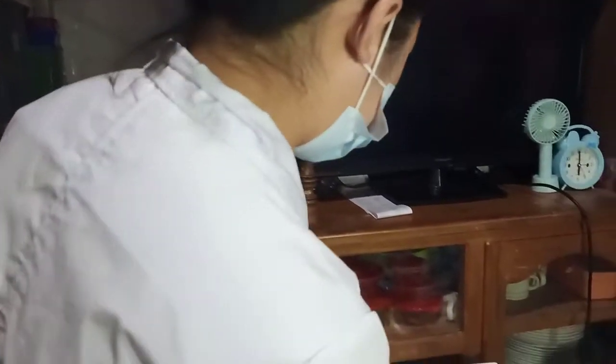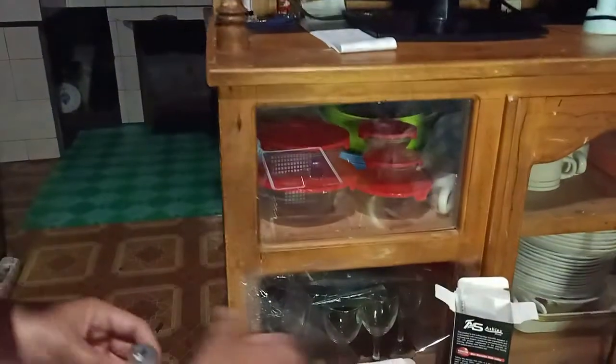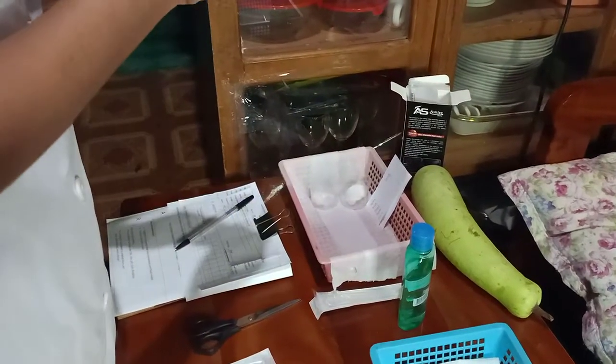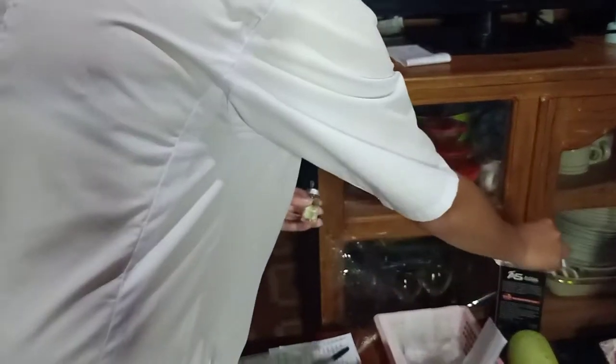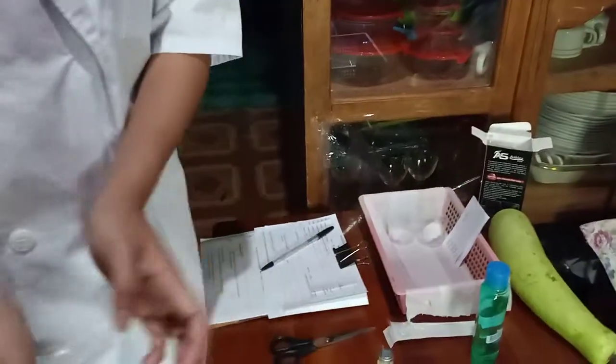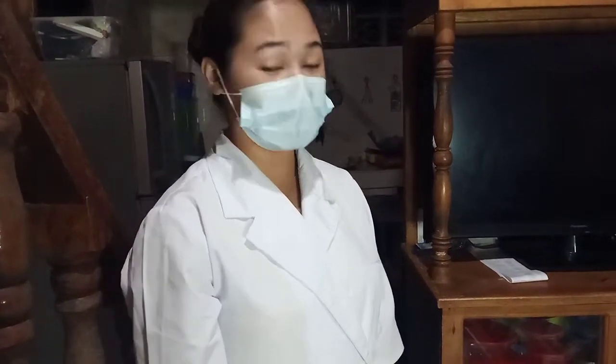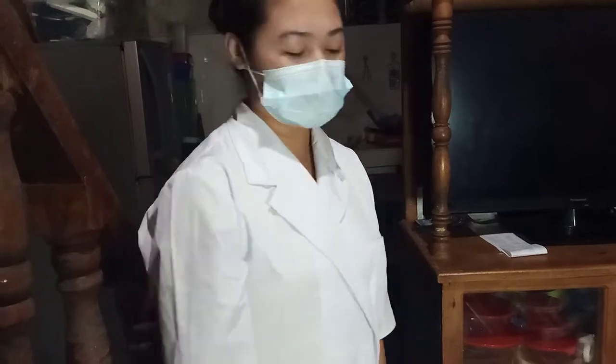And now open the medication vial and clean the surface of the vial. And now inject the air into the vial and draw the exact medication needed, 1 milliliter.